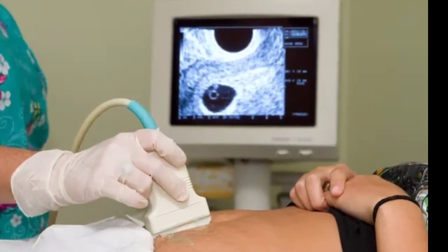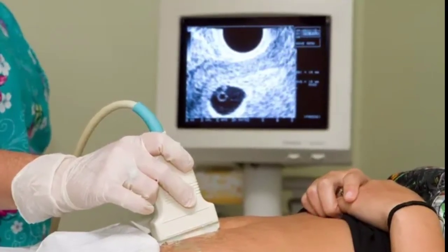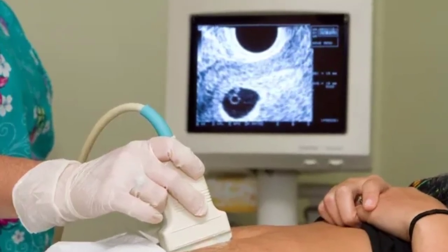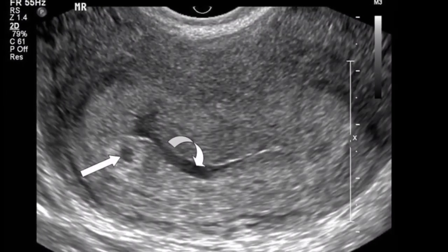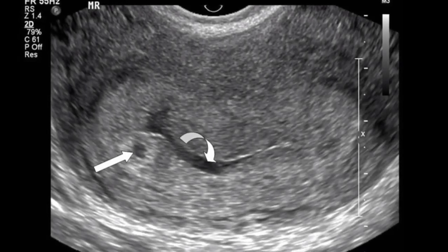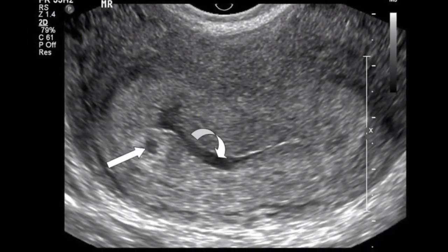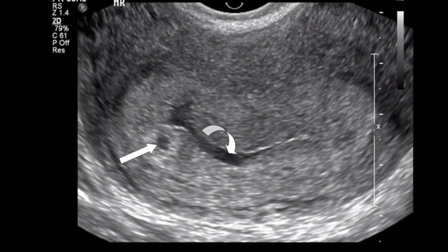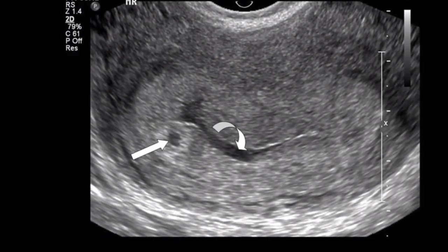The gestational sac is a fluid-filled structure surrounding an embryo during the first few weeks of embryonic development. It is the first structure seen in pregnancy by ultrasound, as early as 4.5 to 5 weeks of gestational age, and is 97.6% specific for the diagnosis of intrauterine pregnancy, meaning it is the only available structure that can be used to determine if an intrauterine pregnancy exists until the embryo can be identified.